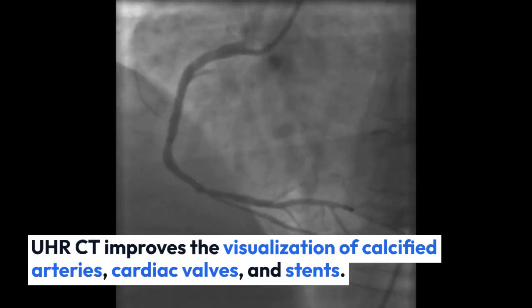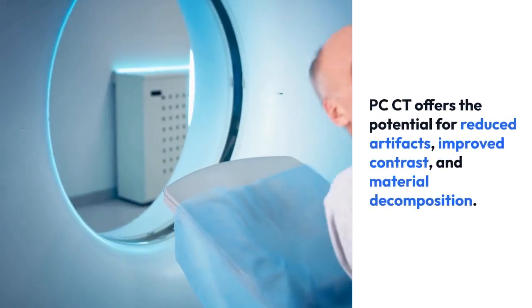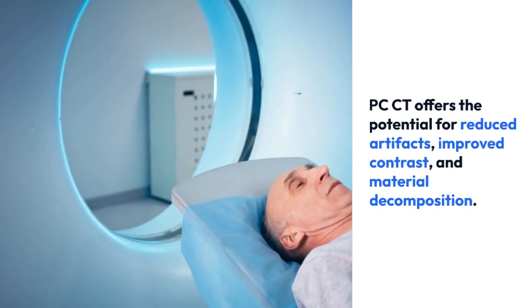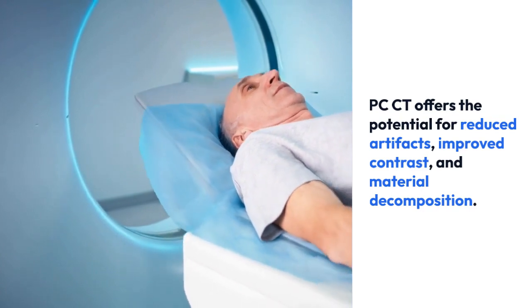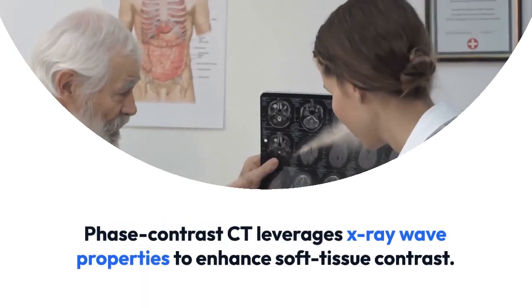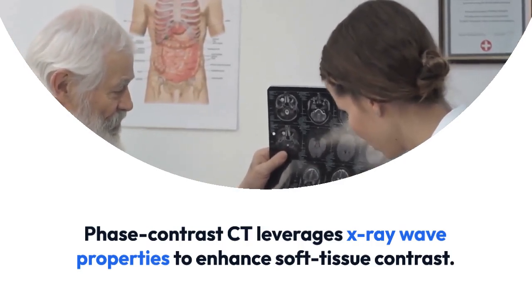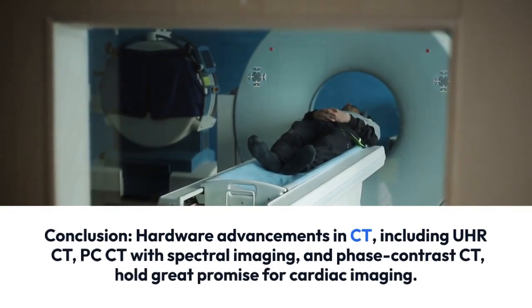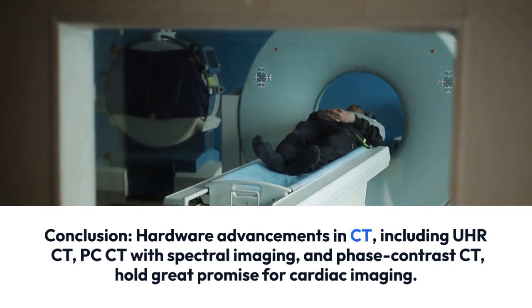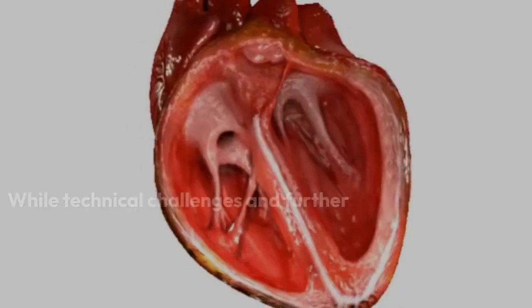In summary, Ultra High Resolution CT improves the visualization of calcified arteries, cardiac valves, and stents. Photon Counting CT offers the potential for reduced artifacts, improved contrast, and material decomposition. Phase Contrast CT leverages X-ray wave properties to enhance soft tissue contrast. Hardware advancements in CT — including UHR CT, Photon Counting CT with spectral imaging, and Phase Contrast CT — hold great promise for cardiac imaging.